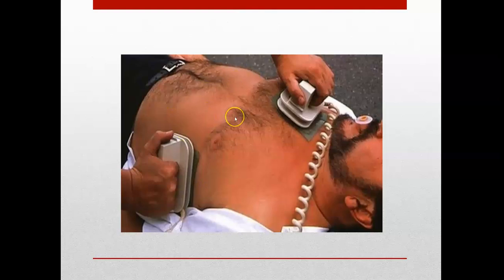And it's also really important that anytime you have a patient with a pacemaker who has had any kind of defibrillation, even if it's with their own, that you interrogate the pacemaker, see what happened in the events leading up, and then you're probably going to have to call the cardiologist, and they're going to have to come in and look at everything and evaluate it.